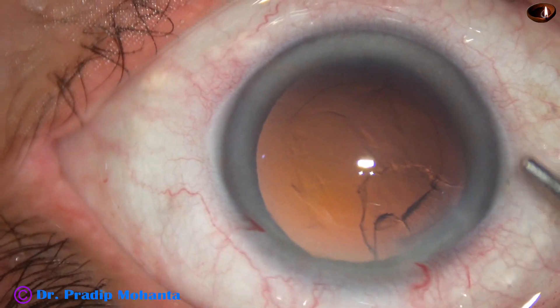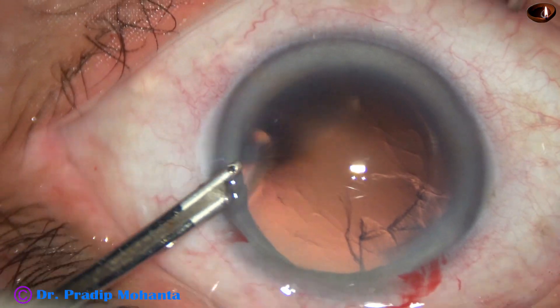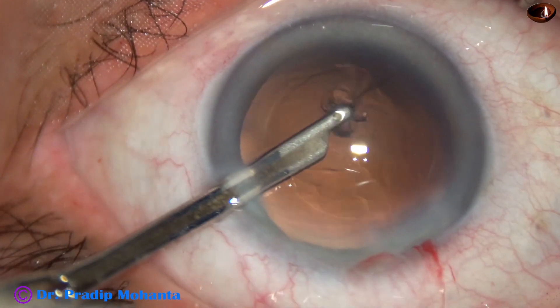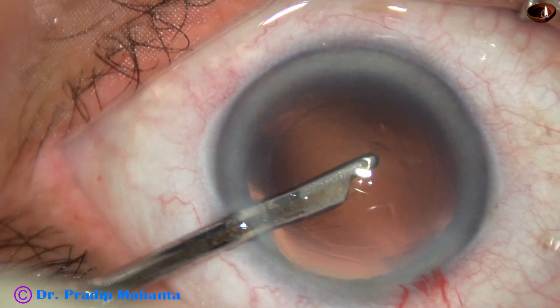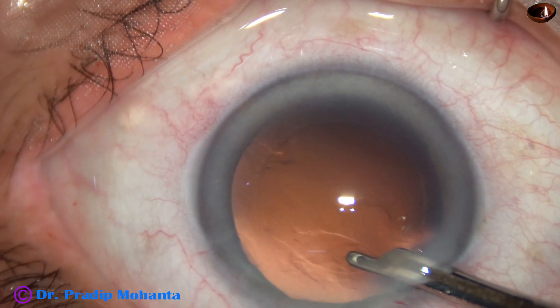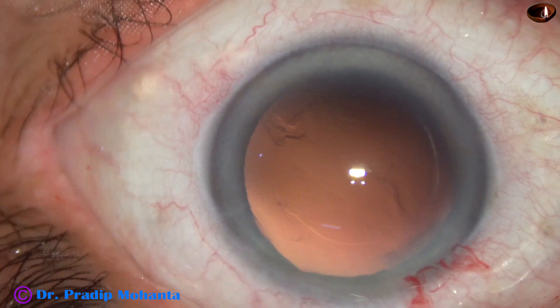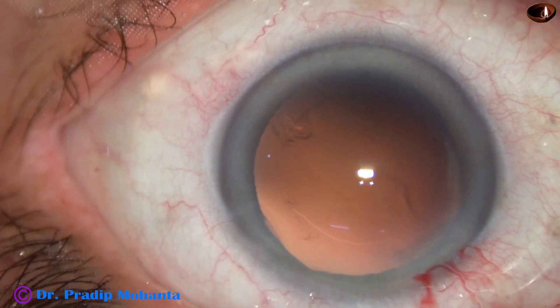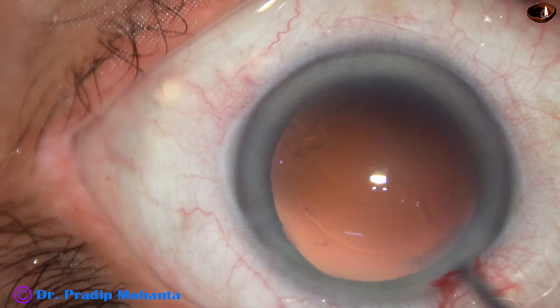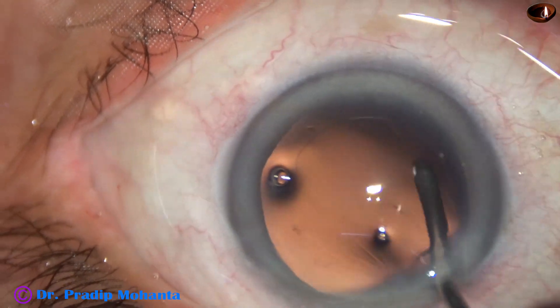The sub-incisional cortex can be removed by the coaxial IA with practice. Going through the side port with the 23G Simcoe cannula to pick up the sub-incisional cortex. We have only one side port about three clock hours away. Even if this side port is a little larger, say about 1.7 or 1.8 mm, there is no harm because the astigmatism produced by the main wound is neutralized to some extent by the side port if it is three clock hours away.